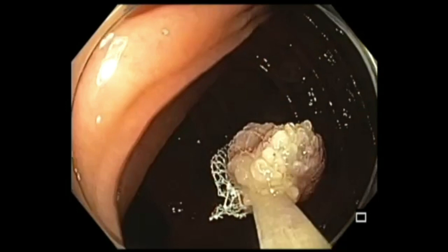It's important when you're opening and closing the net, you should work very closely with the endoscopist so that the wire and the wire frame does not capture the mucosa, and if you don't look at it carefully, you can capture the mucosa of the colon and rip the mucosa. So it's very important to open and close closely, carefully, to retrieve the polyps.